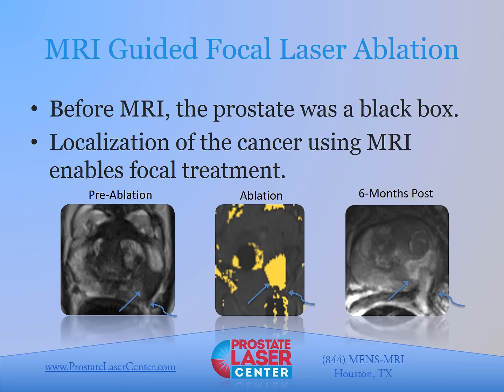Here's an example of an ablation that I performed, and here you can see the power of the MRI. Before MRI, the prostate was a black box. You couldn't really see into it. So if a patient had cancer, you'd take out the whole thing. But now that you can see where the cancer is, you can see the edges of it, you can see its characteristics, localization of the cancer using MRI enables focal treatment.